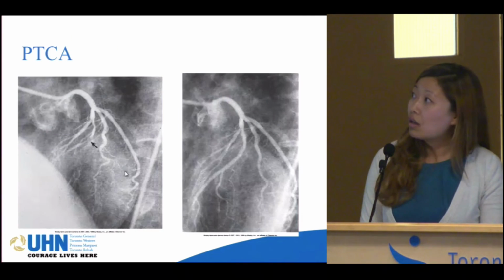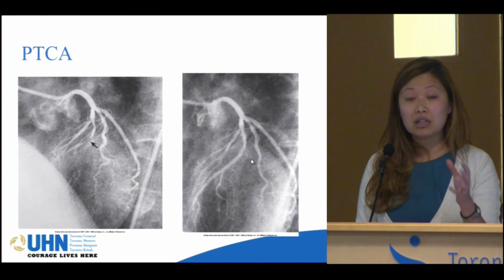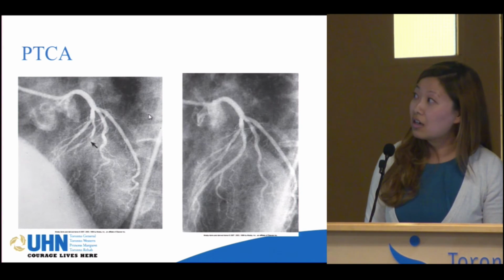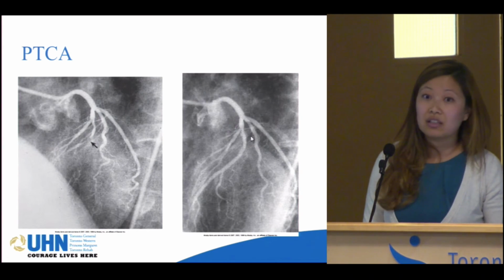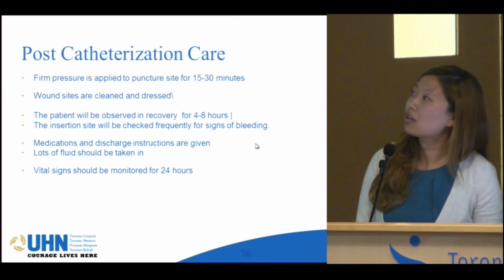Okay. So you can see this one's kind of cool. No flow, intervention, flow. So it's not the exact same image only because the heart has moved. So we can't get exactly that, you're seeing the three branches exactly in this manner. That's the only reason why, if you're being picky on me here.